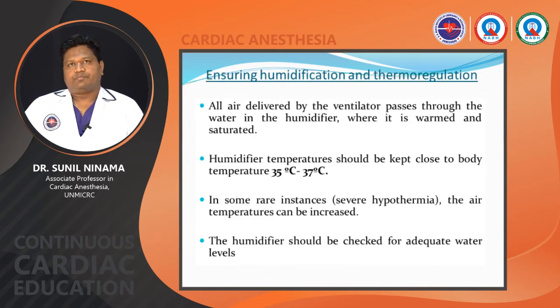Now, when your patient is on a ventilator, you have to give the patient humidification. Why? Because all air delivered by the ventilator passes through the water in the humidifier, where it is warmed and saturated. The humidifier temperature should be kept close to body temperature. In some rare instances, such as severe hypothermia, the air temperature can be increased. The humidifier should be checked for adequate water levels.